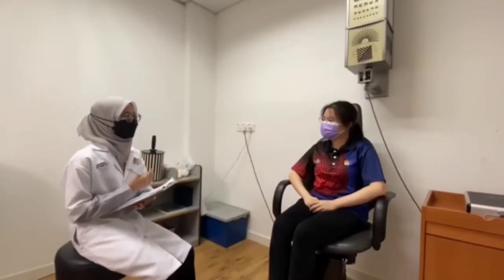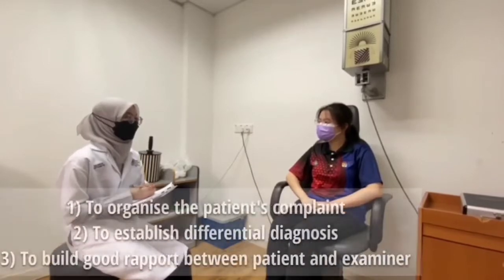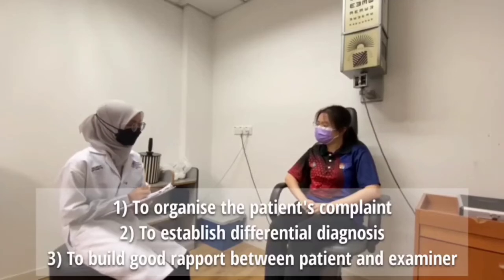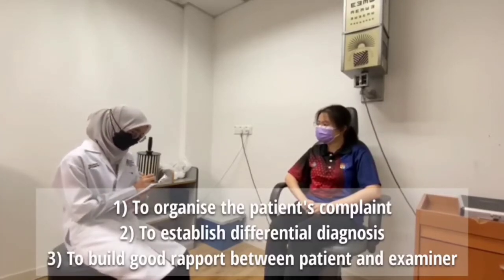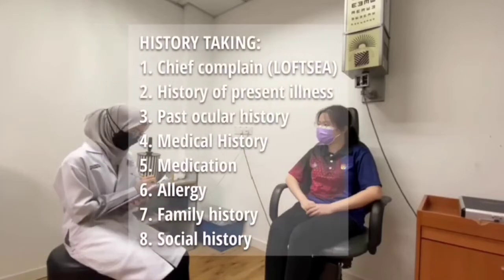Firstly, the examiner will do history taking. It is to organize the patient's complaint, filter the information, establish a tentative differential diagnosis, as well as build a good rapport between patient and examiner. This is the procedure of history taking.